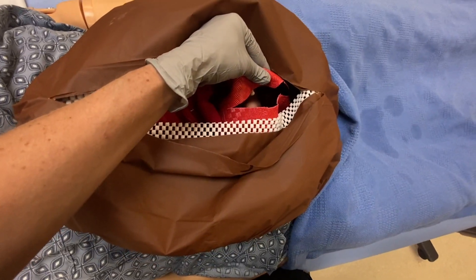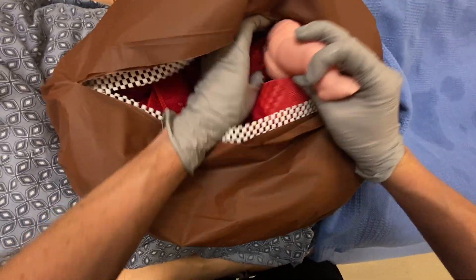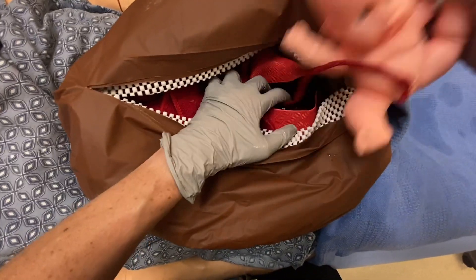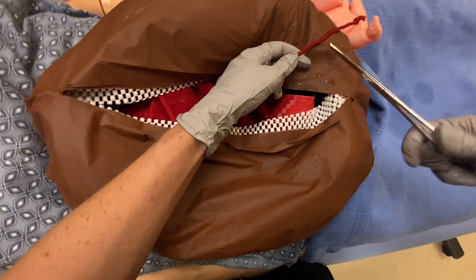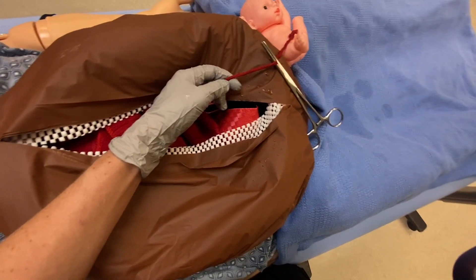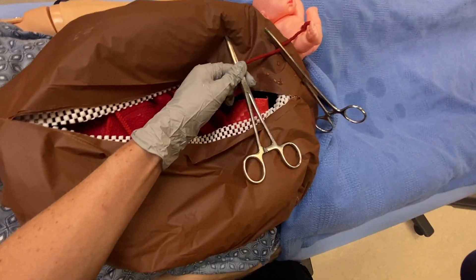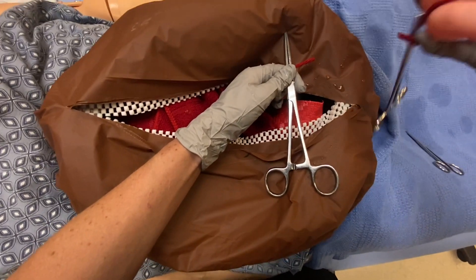Once you have the uterus open, you can see baby. We're going to pull baby out. We're going to grab our clamps and clamp on either side of the cord. We're going to cut the cord and hand baby off to our NICU team.